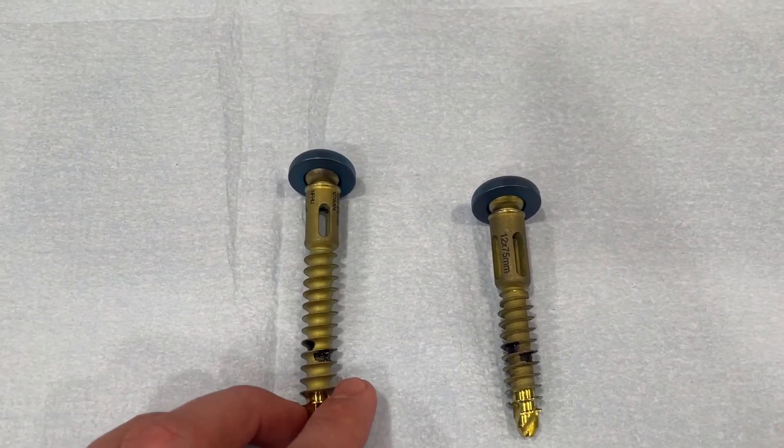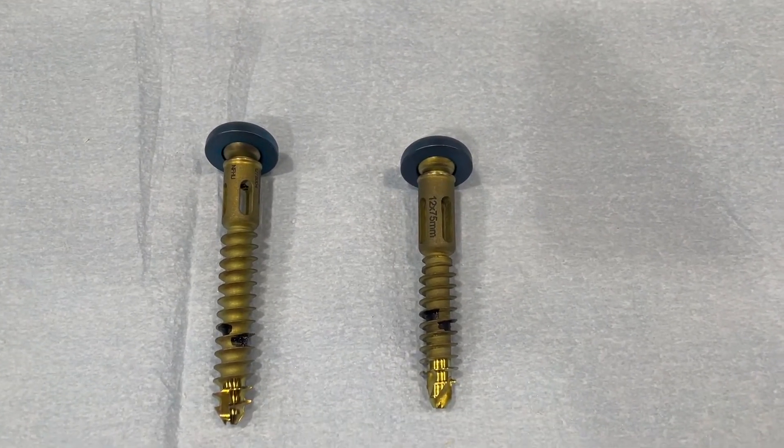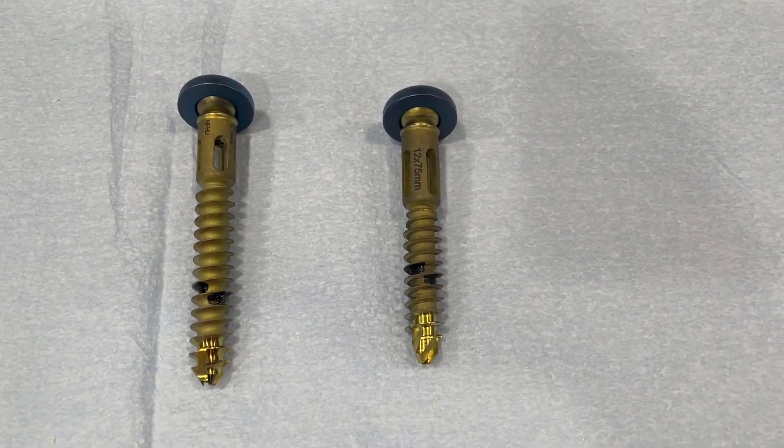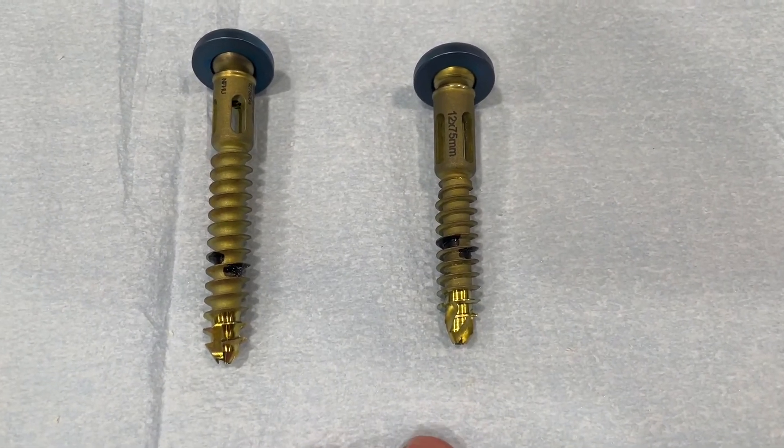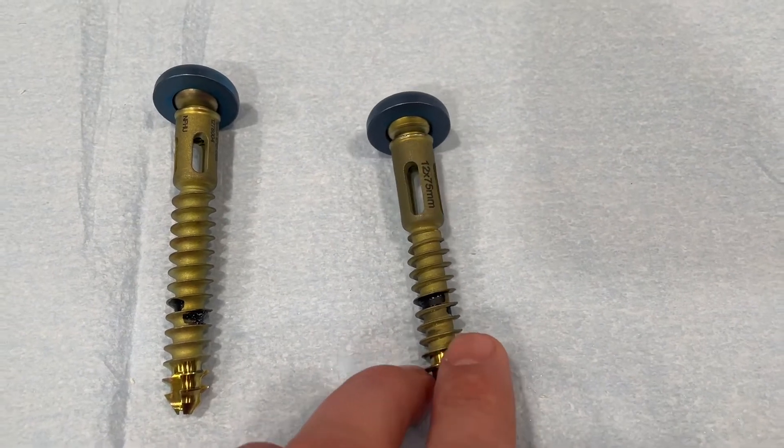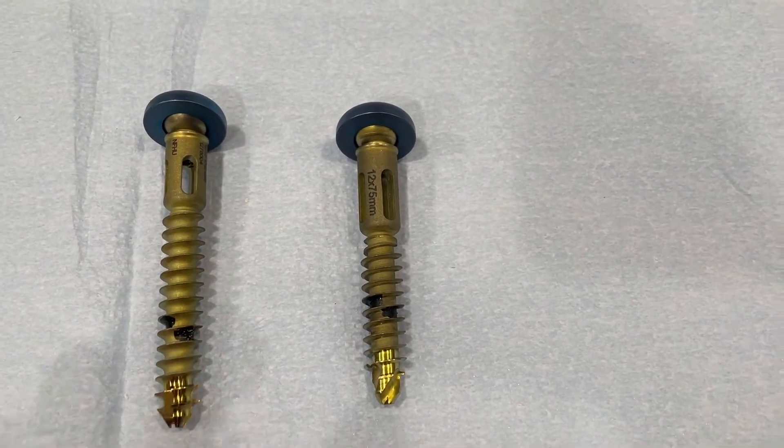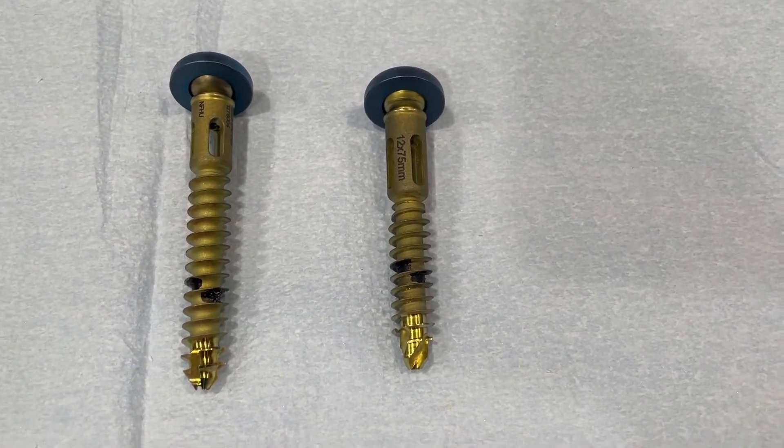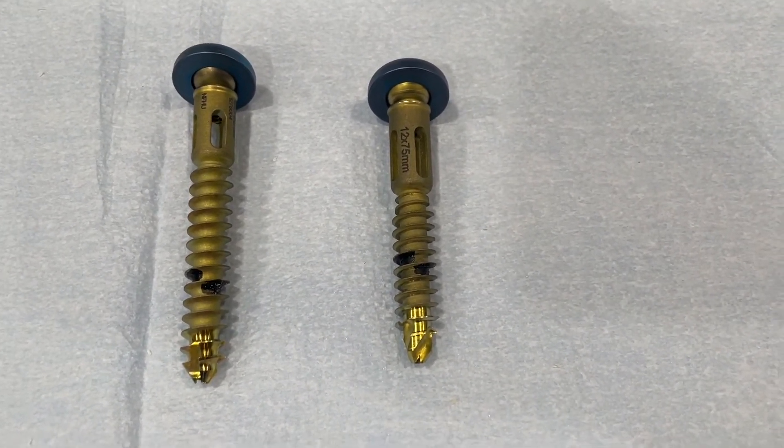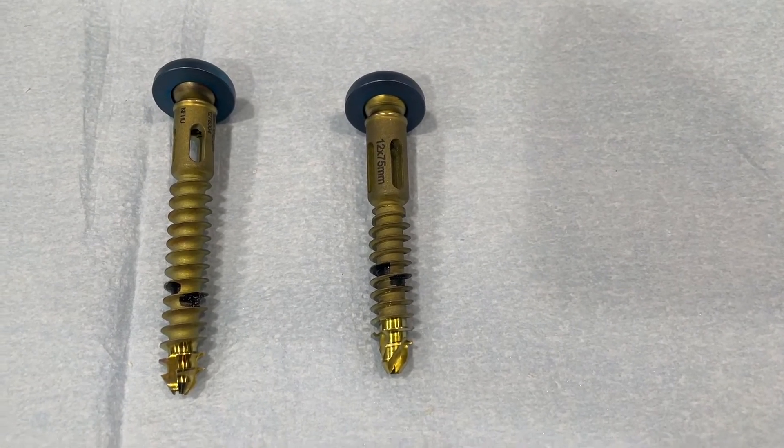The implant on the right utilizes a proprietary thread known as UniFi MI. MI stands for mechanical integration. The way this works, there's proprietary undercuts on this thread that allow this to mechanically lock into the bone, and it's the first new method of securing an implant to bone since the discovery of osseointegration in the 1980s.